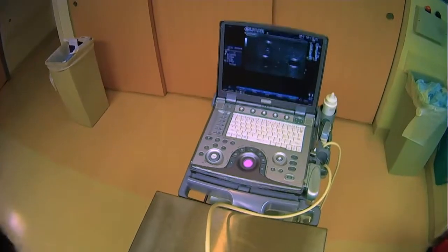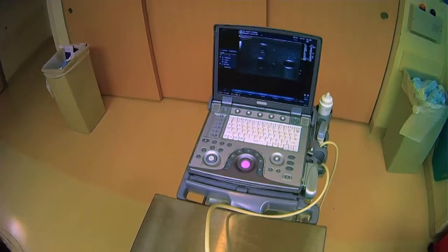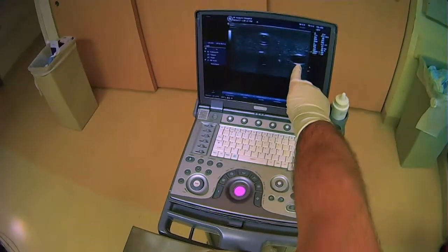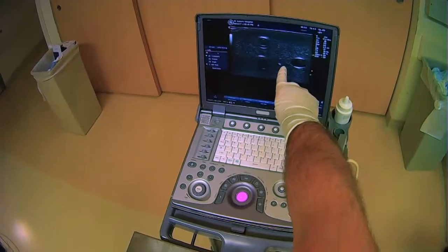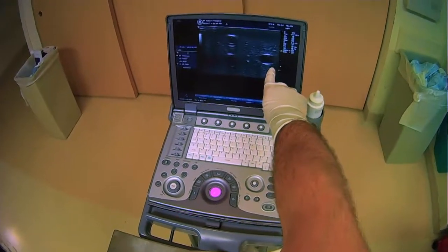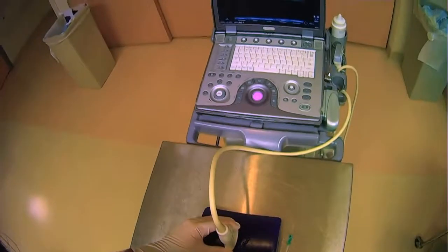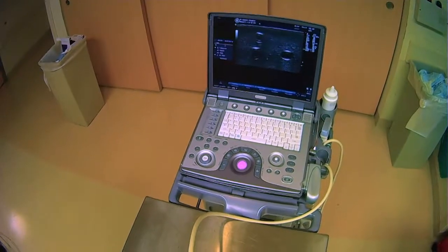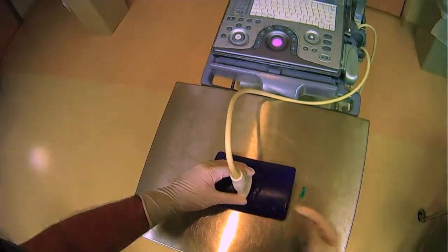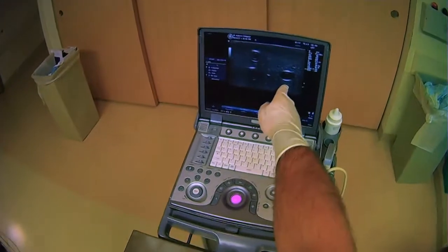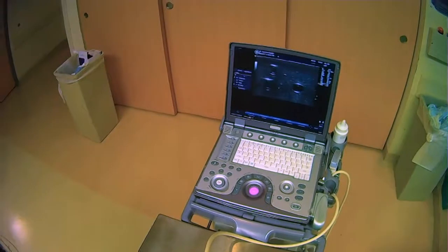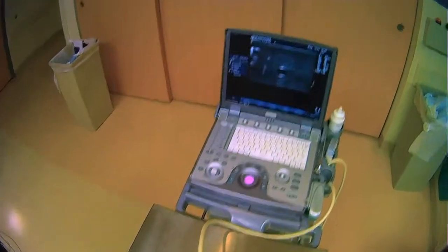It's important to position your target appropriately when you're doing these procedures. Right now, let's say this is our target here — we can see that it's to the right of the screen. What we want to do, especially in this plane when we're dealing with a target like this, is recognize that the vessel is running perpendicular to our probe and we're just seeing a cross-section, which is why it looks like a circle. We want to put that circle in the middle of our screen.